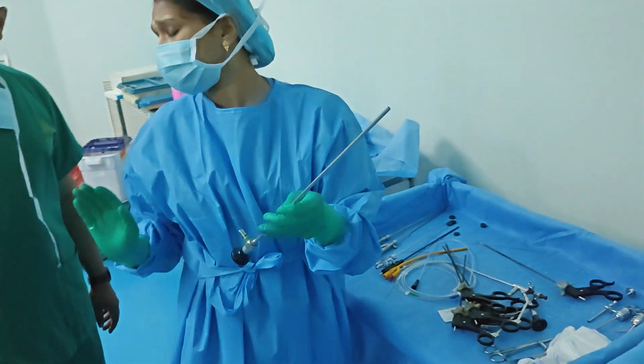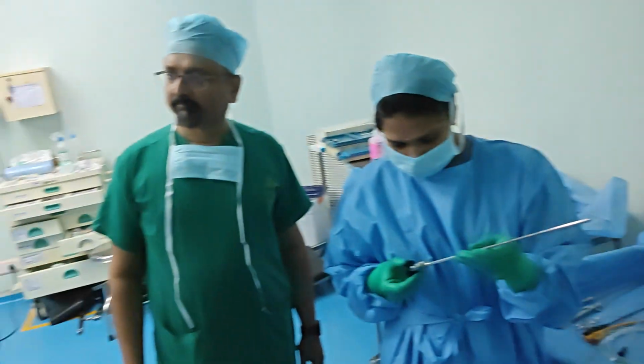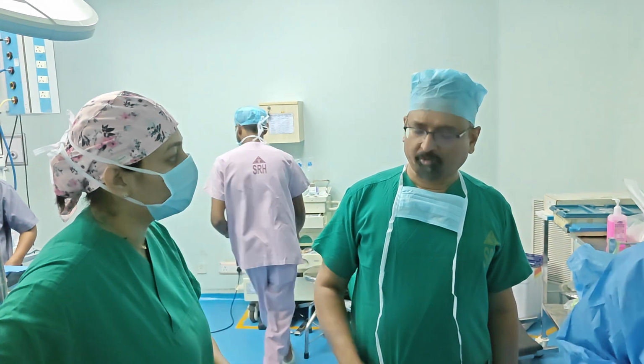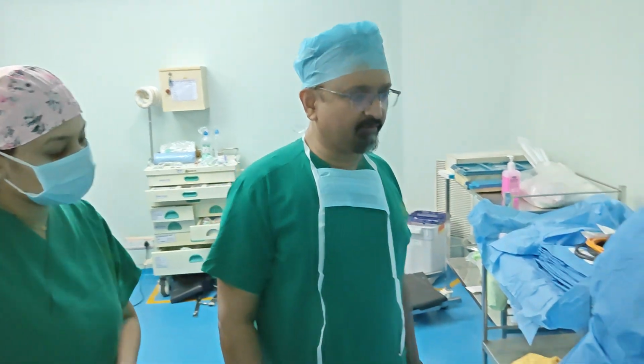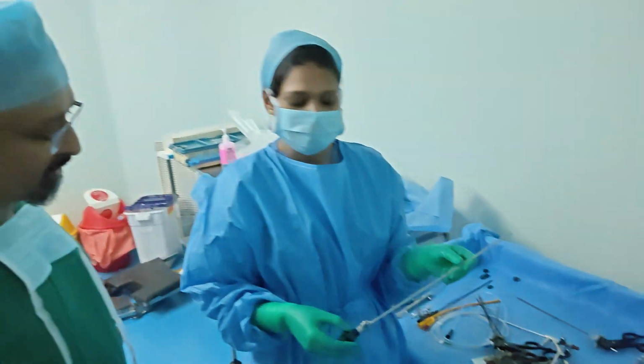0 degree or 30 degree? 30. Why do we prefer 30 degree? So that, for putting the port also, we can save time. Most often the port goes from the roof, so you have to see what is below. So 30 degree is always better. You can rotate it when you are putting the instrument.